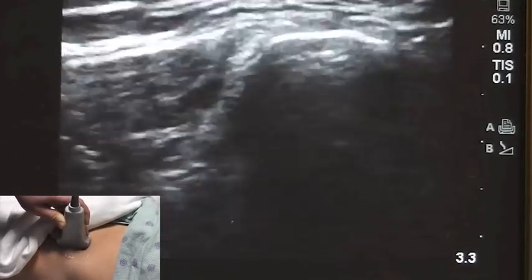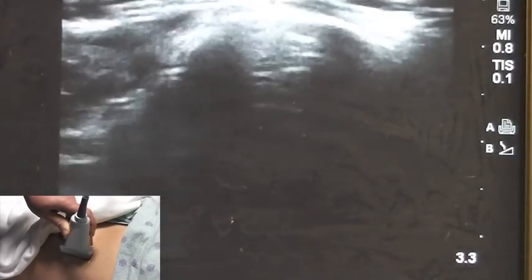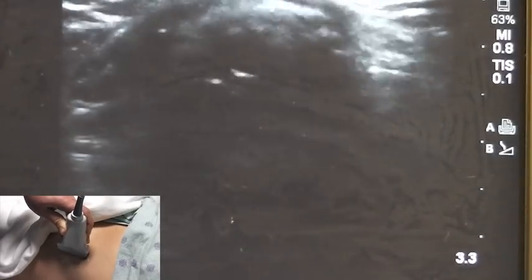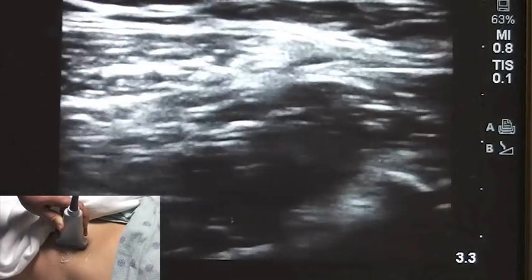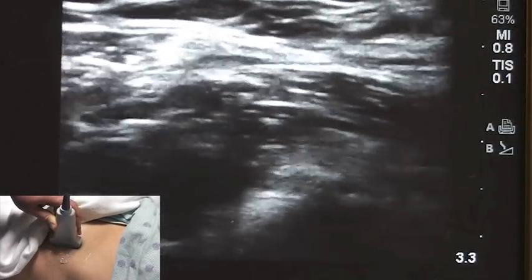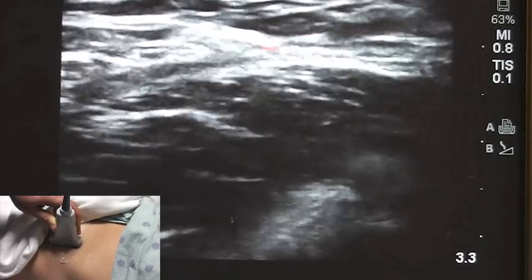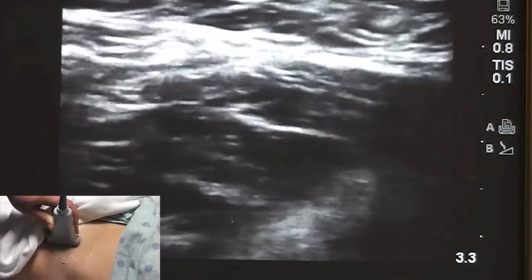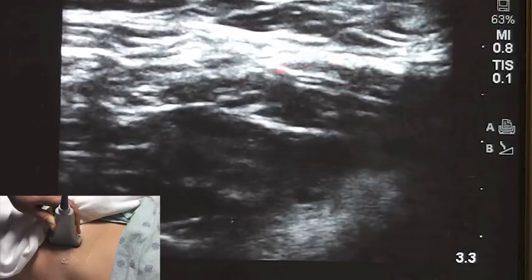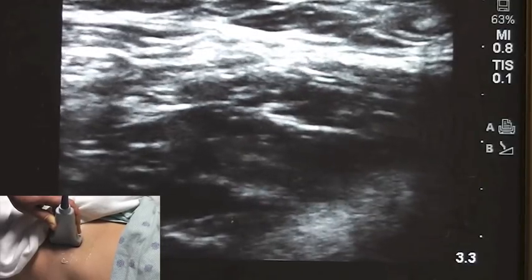The view you are looking for when performing this block — starting from the ASIS as discussed, when you turn the probe — is a view that looks similar to a bow tie. As you can see, there is a bow tie connector right here, the top part of the bow tie right there, and the bottom part right there. That is the structure you are looking for, and the fascia right here is the fascia iliaca.